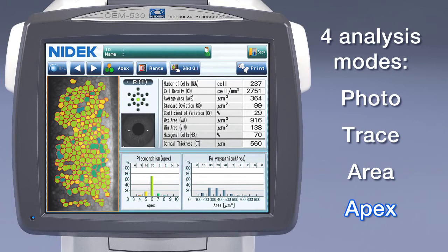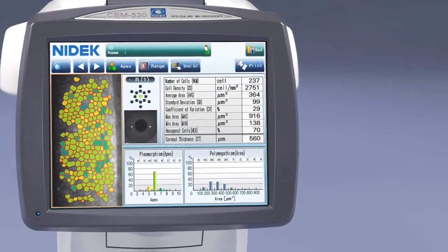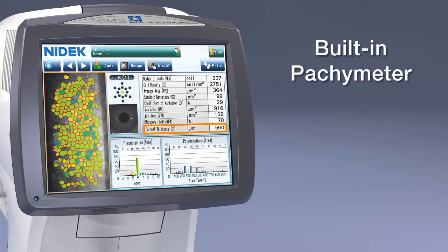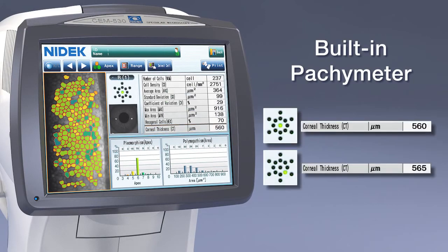The CEM530 provides a built-in pachymeter, which measures corneal thickness at each of the central, paracentral, and peripheral points.